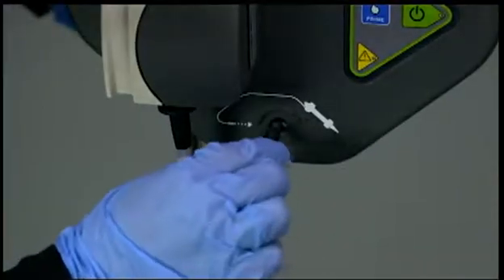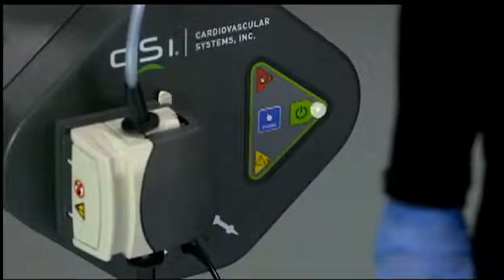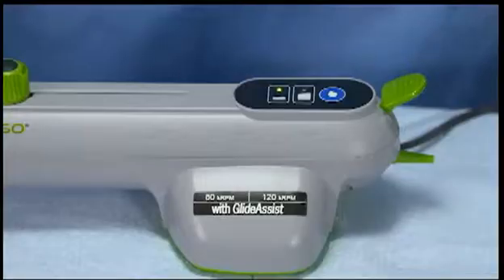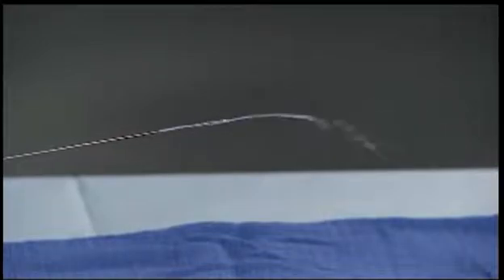Connect the OAD power cable to the pump. Next, purge air from the OAD. Press the green start button and check that the green LED is lit. Press and hold the prime button on the front of the saline pump or on the OAD to purge the system — it will pump saline at an increased flow rate as long as the prime button is held down. When the prime button is released, the rate of saline flow will decrease to the low flow rate after 3 seconds.